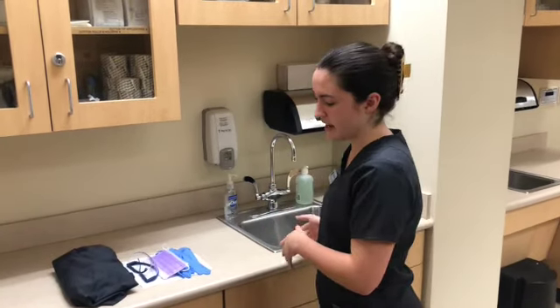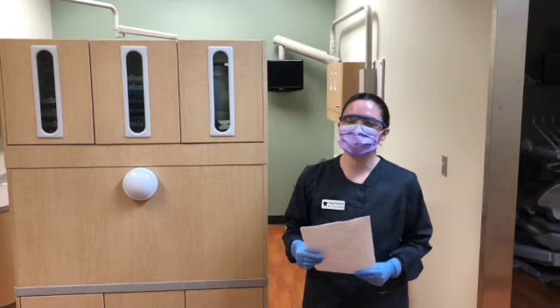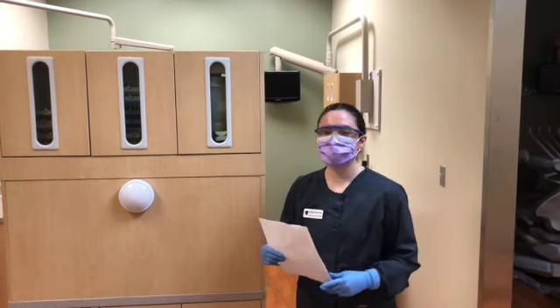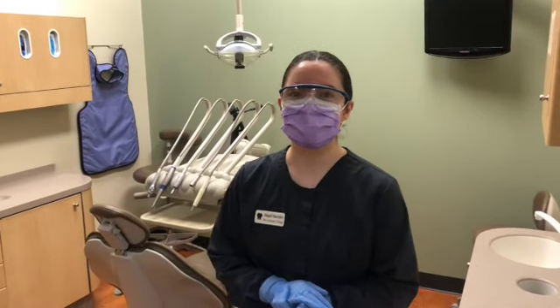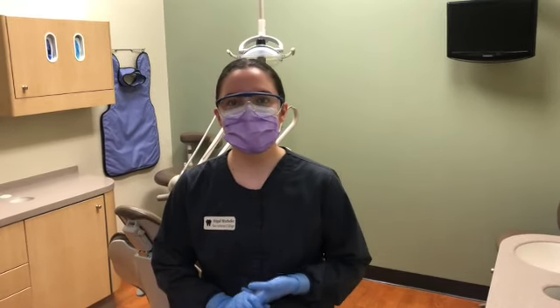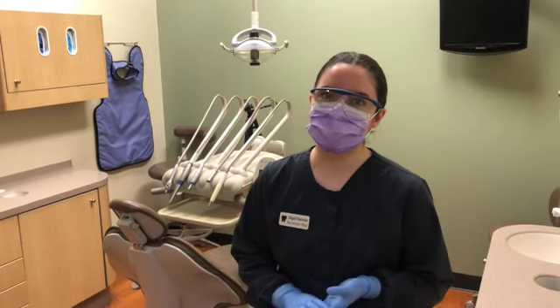The next step was to remove all PPE, wash hands, and then apply all proper clinical clothing according to OSHA guidelines. Now that we've applied proper clinical clothing, we will now review the patient's schedules and prepare the room for the first patient. To prepare the treatment room for the first patient, we will need to apply all proper barriers, check supplies, and review patient records, as well as preparing appropriate trays and lab work for the first patient.